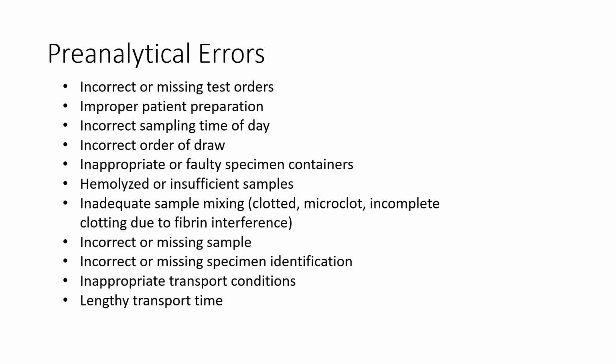especially when we're talking about molecular type tests or evaluating the presence of RNA. RNA is very unstable with it being single-stranded and such, so that's something to take into consideration. That lengthy transport time and the type of transport is really important to prevent these pre-analytical errors.